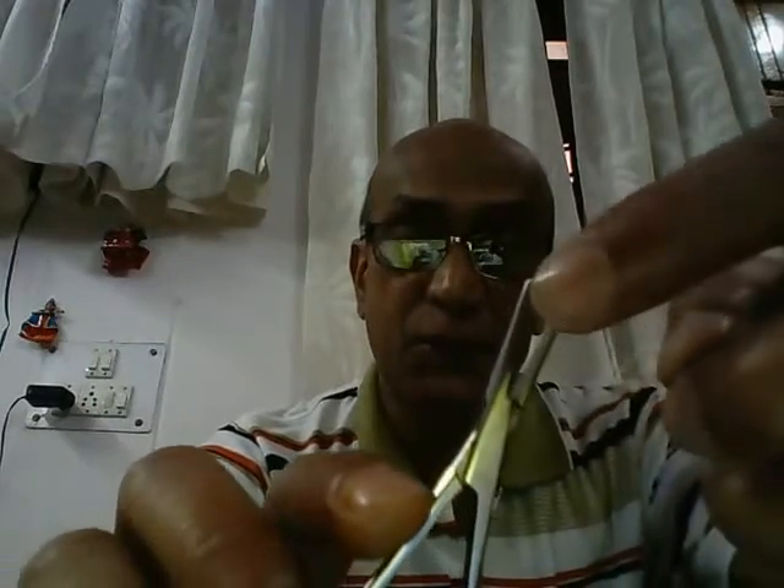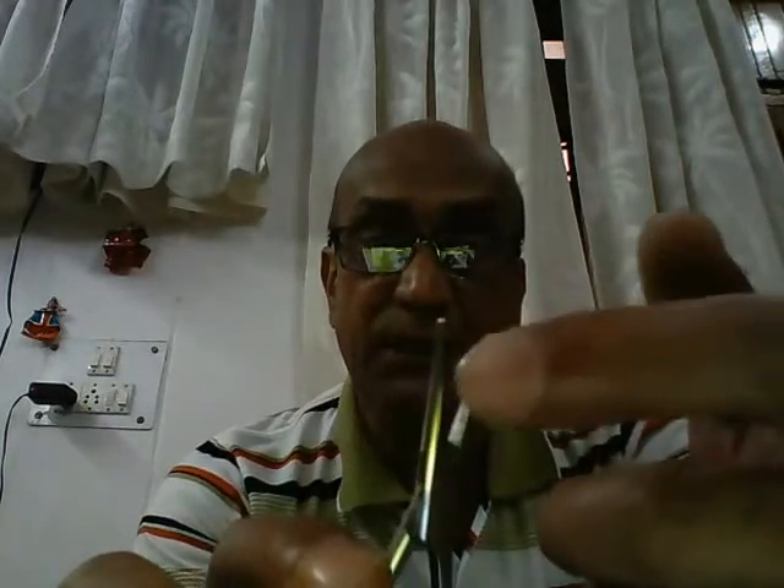And finally, we have the jaws. The jaws are different in an artery forcep compared to that of a needle holder. In a needle holder, the jaws are small and more stout because they have to hold the suturing needle. In this case, the jaws are a little long and more slender. And if you see the inside, you'll find a number of horizontal serrations.